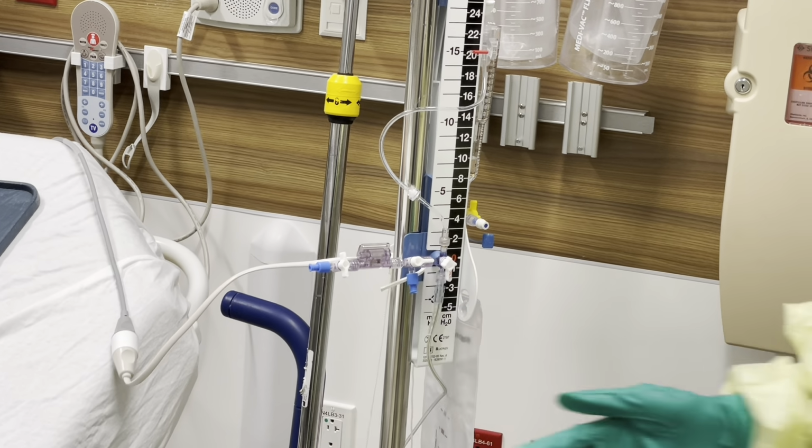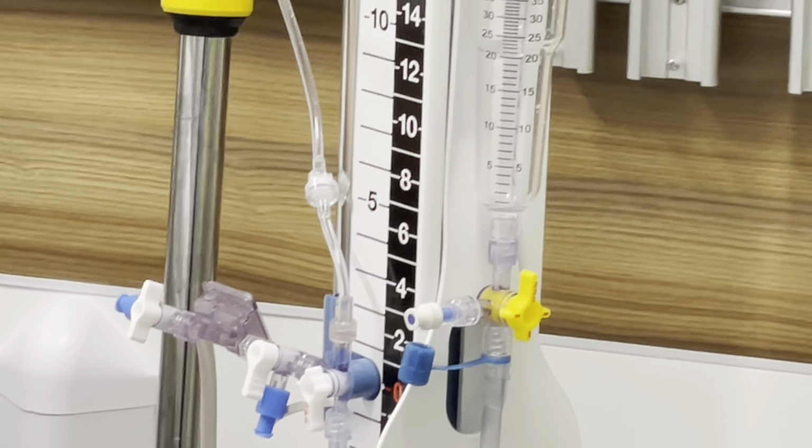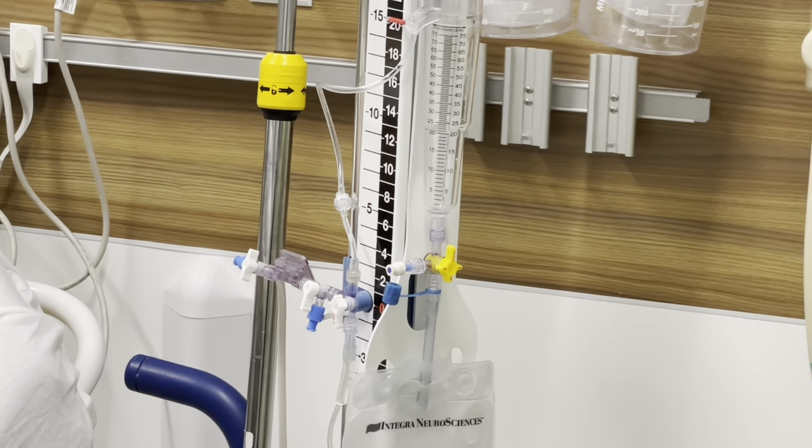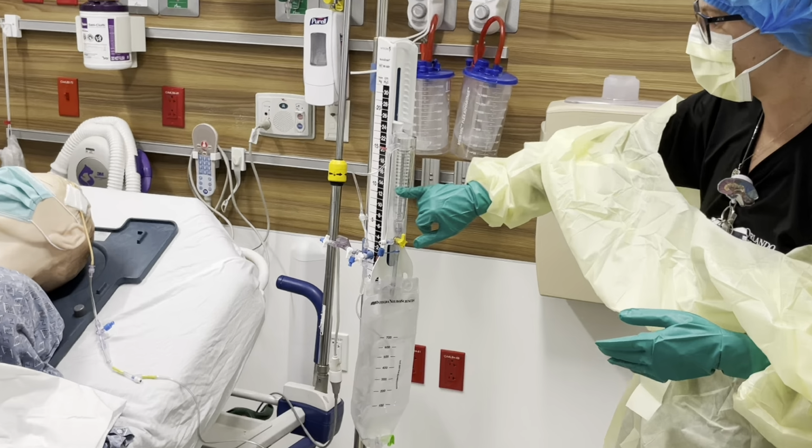So before you start messing with any of the stopcocks to your patient, you're going to look at your drain system, where we just flushed our sterile saline. All of this is sterile saline. It's not CSF. It's not to be accounted for. That's something that we did. So we're just going to empty it, dump it right into the bag, okay? And then you're going to flip it back up. It's very important that you make sure that this is closed and that you're only emptying it every hour. If you leave it open, you don't know how much CSF you're draining. CSF drainage is going to be different for everyone depending on their mechanism of injury. I would say that you have this little chamber here that goes between 20 and 25.